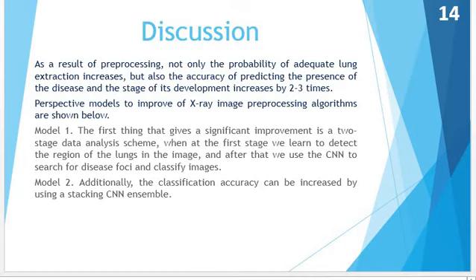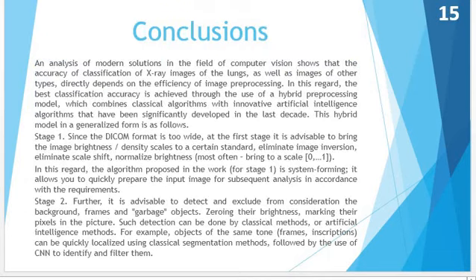Perspective models to improve X-ray images preprocessing algorithms are shown below. There are two models. Conclusions are on slide 15 and slide 16.